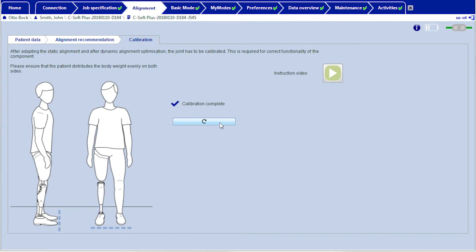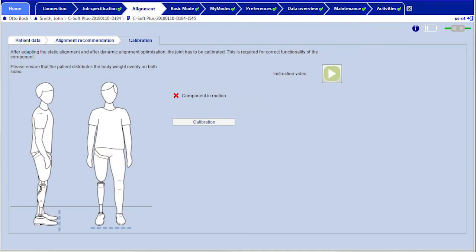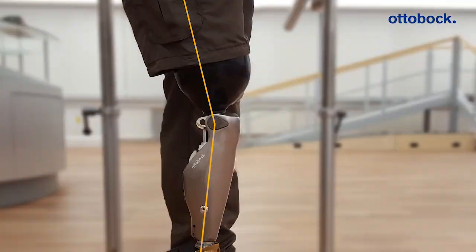If one of the three listed criteria is not met, for example because the user moves during the calibration, a message appears in the adjustment software. Make sure that the user stands still with his or her leg extended.